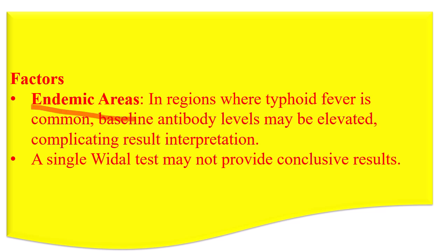Endemic areas. In regions where typhoid fever is common, the baseline antibody level may be elevated, complicating result interpretation. A single Widal test may not provide a conclusive result, so another Widal test may be performed after 7 to 10 days for confirmation of typhoid fever. Those are some limitations which affect the Widal test result.